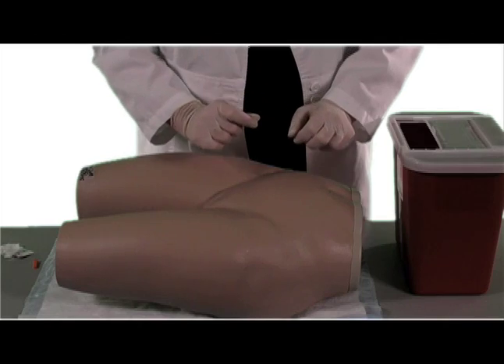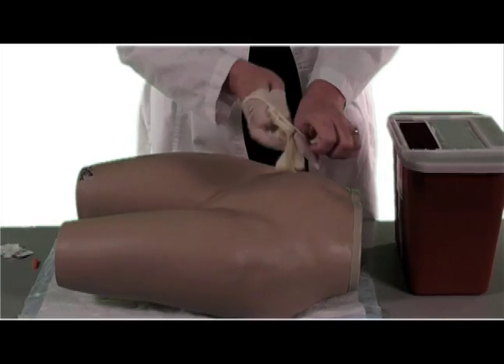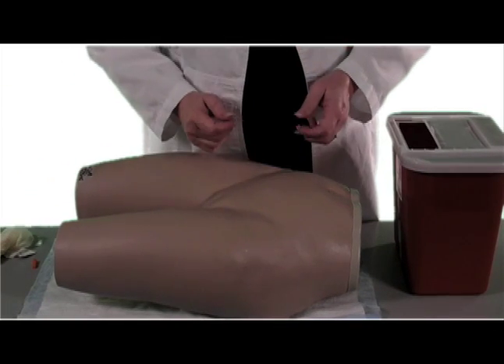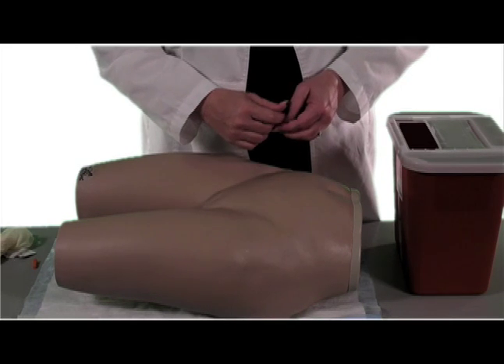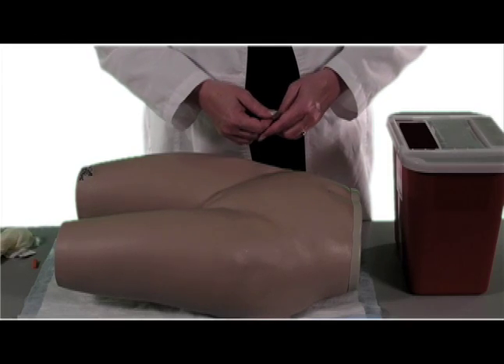Put your needle in the sharps container. Remove your gloves. That is the way you give a subcutaneous injection. There is no need to hold pressure, massage, or place a band-aid over that injection site. And that's how you give a subcutaneous injection into the abdominal region. I'm Sherry Taylor, one of the Directors of Nursing with RNBridgeProgram.com. Stay tuned for more videos.